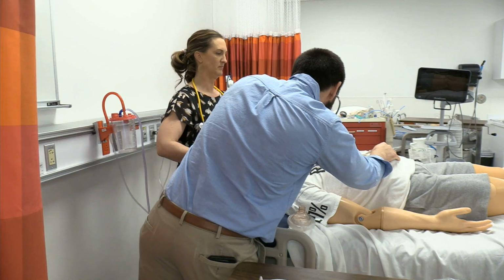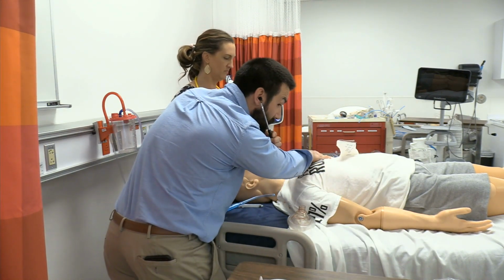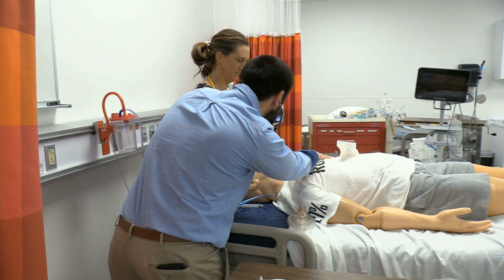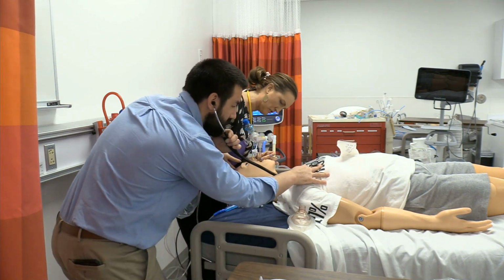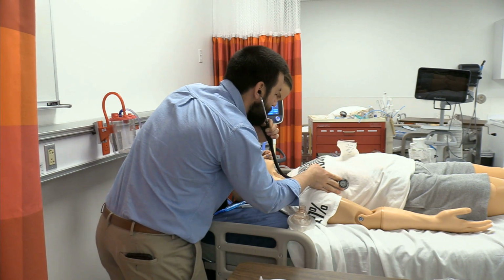Breath. Okay, nothing over the stomach. We got positive color change, so we'd be seeing that going from purple to yellow. You want to be very verbal. All right, give me a breath every time I move. How deep are you, doctor? Oh, 26 at the teeth. Is that inches or centimeters? Is that centimeters?